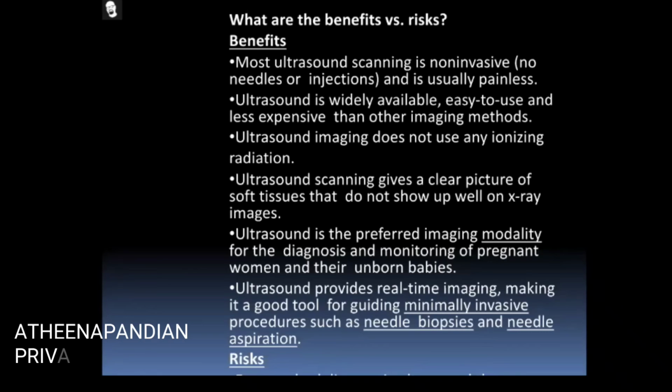Simply, when the probe is placed over the skin, the monitor will show the internal organs. That's all. There is no illness and no uncomfortable feelings for both the users and the patients. Ultrasound is widely available, easy to use, and less expensive.